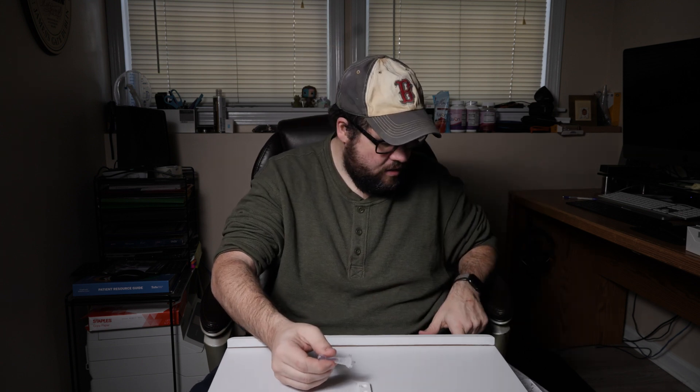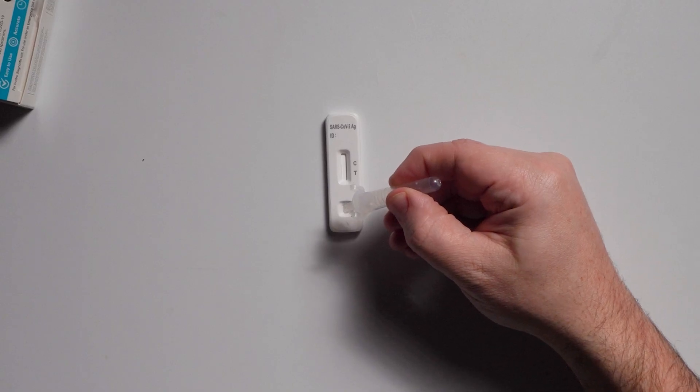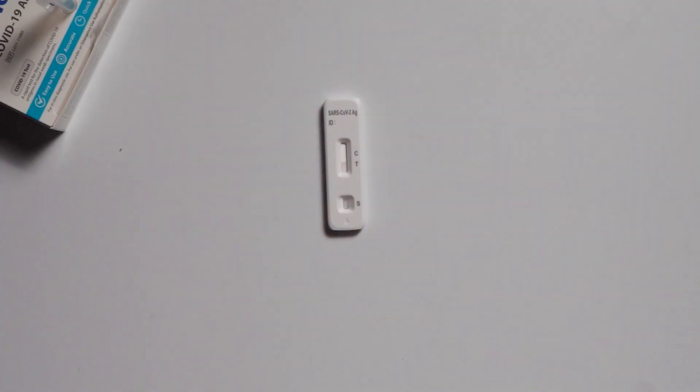Now we're going to do the rapid test part. Four drops into the S area: one, two, three, four. You can see the liquid kind of coming up.